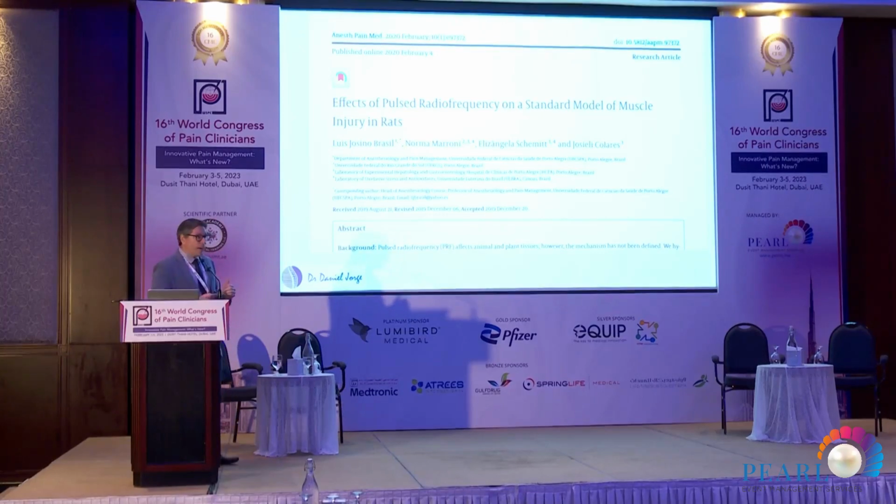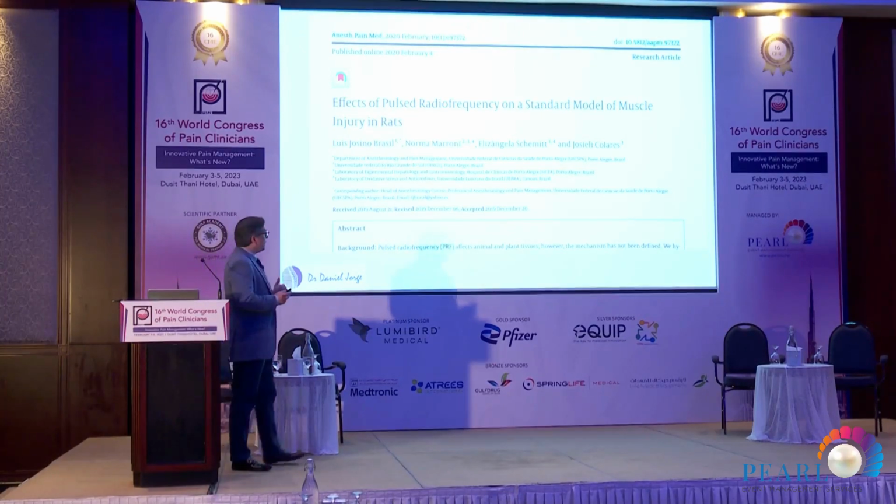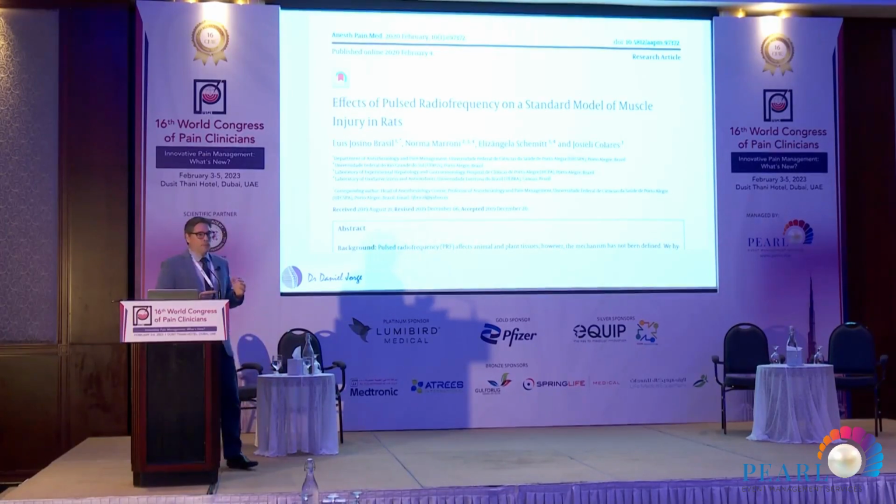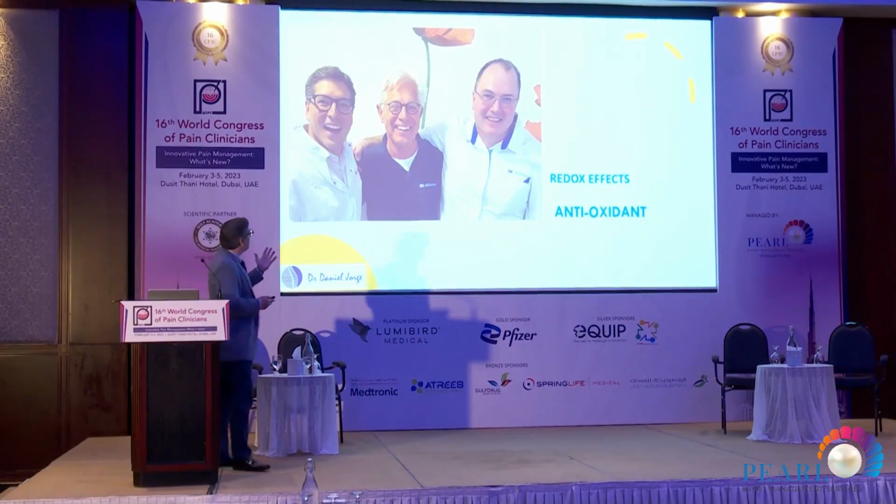And it's quite interesting because it seems that the pulse radiofrequency can organize in some way the release of ROS, the reactive oxygen species, but in the oxygen atom, it spins in a better condition for the cell to use it in a triplet model. And that's Professor Josino Brasil.